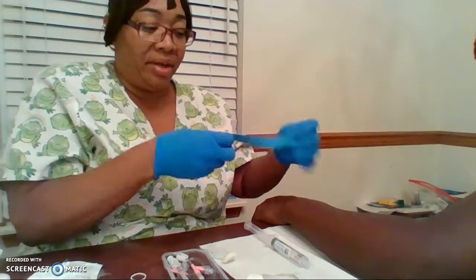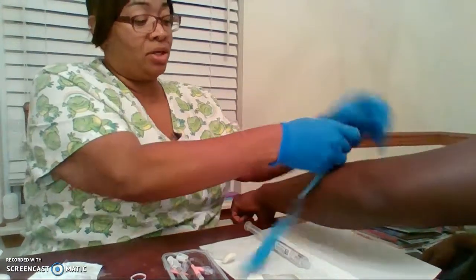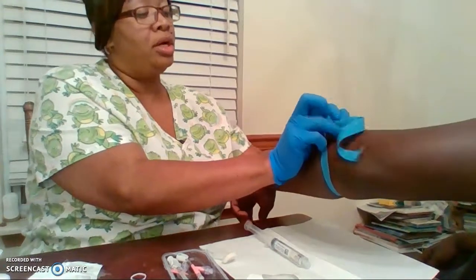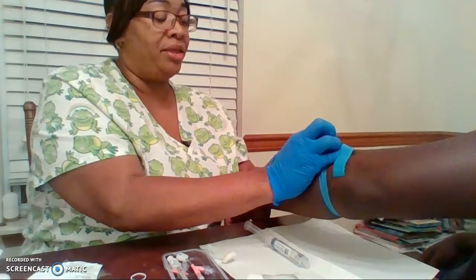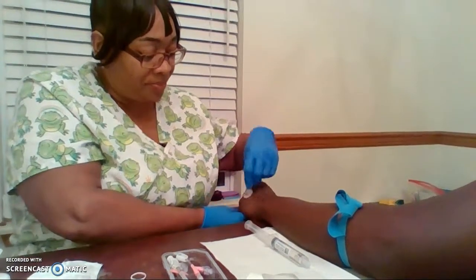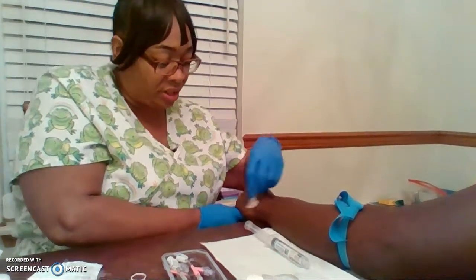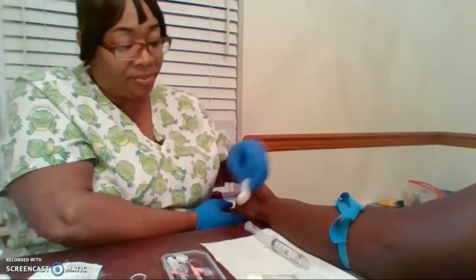So we're going to go ahead and apply the tourniquet to the patient's arm. We've already inspected the arm to find where the veins are located that we're looking for. You're going to tie a slip knot that can easily be released when you're no longer needing that. And then you're going to clean the patient's arm and or hand or wrist. I'm going to start this one in the hand because this gentleman has really nice veins in his hand.